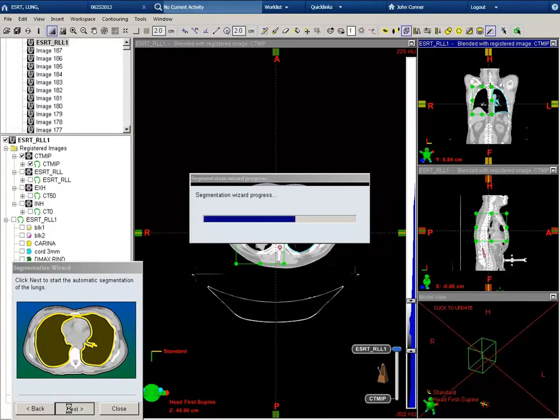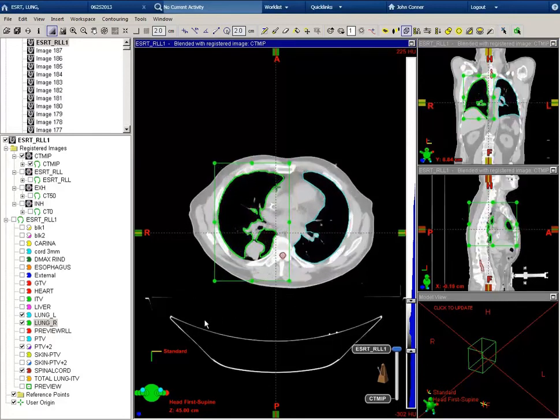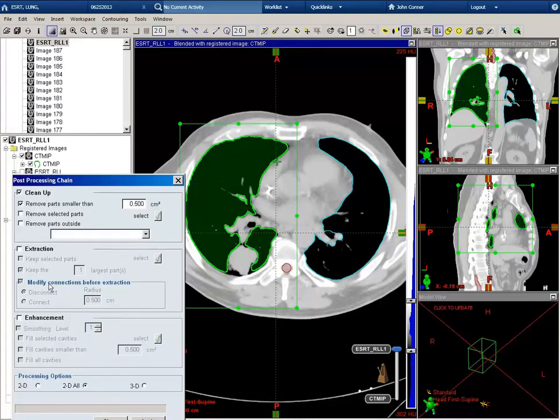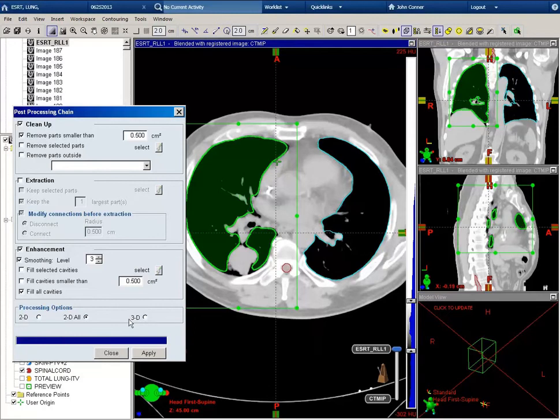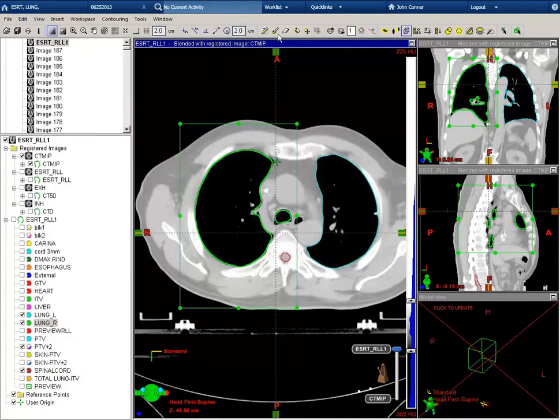And next again, and this will autofill our right lung volume. The next step is to post-process this volume, so go to the post-processing icon. I will select enhancement, smoothing, and fill all cavities. Then go ahead and hit apply, and use fill all cavities. This will just help minimize our manual adjustments.